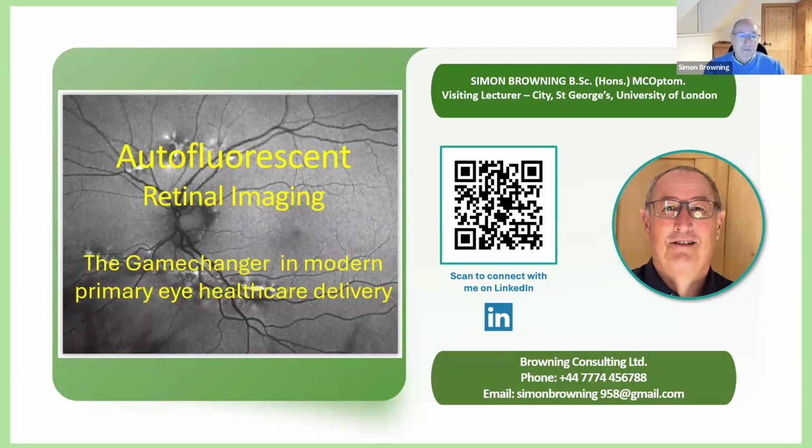Thank you very much. So tonight is about autofluorescent retinal imaging, which is part of the ultra wide field system analytical tools. Autofluorescent imaging is, to me, one of the most exciting things that ever happened in modern optometry. As I might have mentioned in the last lecture, it completely revolutionized the way that I was dealing with my patients. I want to share with you tonight some of that reasoning, and give you a taste for what we're going to be looking at.